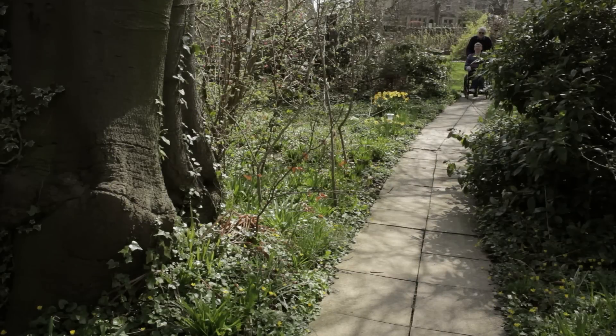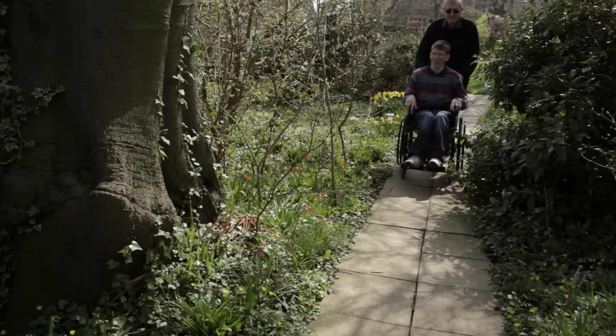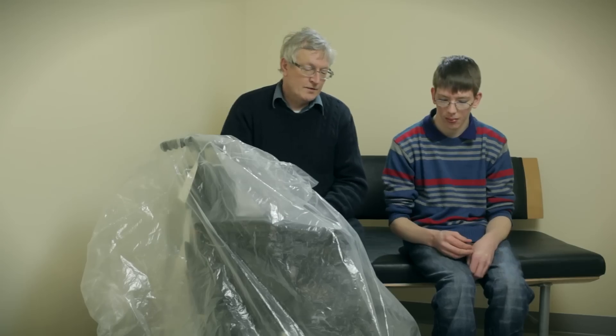This video will explain to you how best to use your new wheelchair. By learning about your new equipment, you will know how to operate it safely and keep it running well.